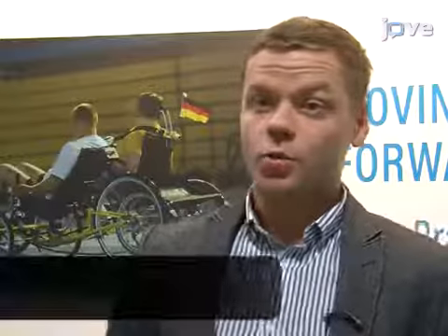Electromyography is often used as a control input for assistive technology. As many patients require specific solutions that are prohibitively expensive, we developed a cheap, easy-to-customize device. Here, we present two Bionic clicker systems, Mark 1 and Mark 2, that allow the wearer to change the slide of the presentation by raising their index finger.